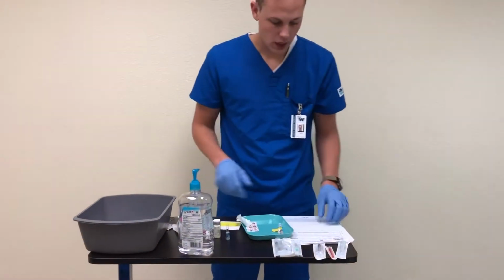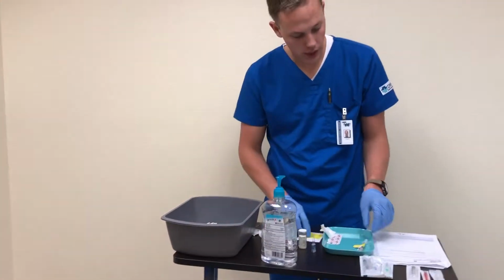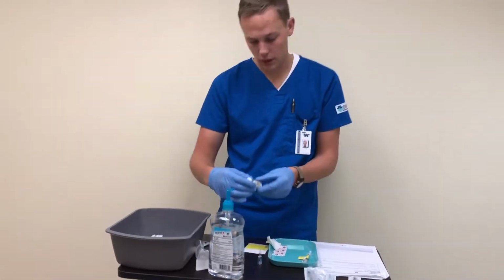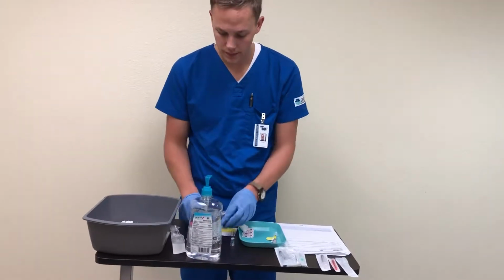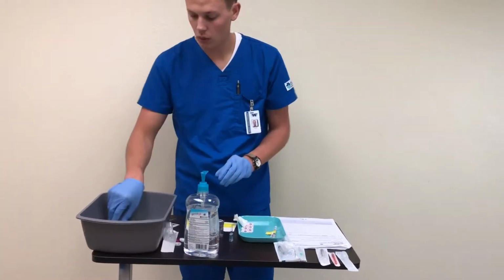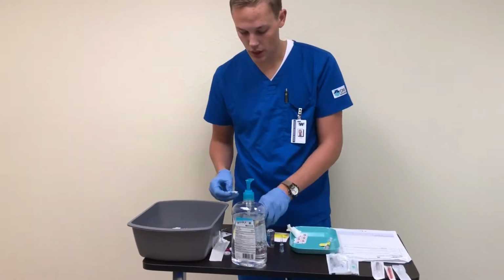Okay, and then next we're going to move on to the ceftriaxone, 250 milligrams IM. And again, that is another powdered one. So we're gonna uncap these again. And we're going to wipe them down as we did with the previous ones for 10 to 15 seconds.